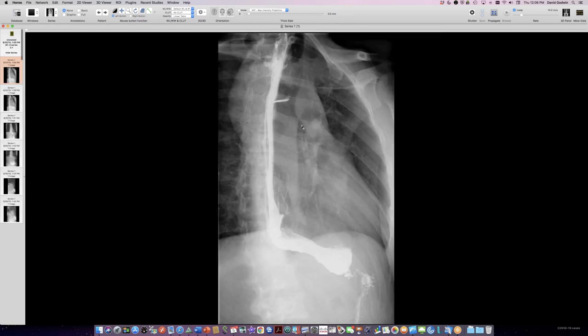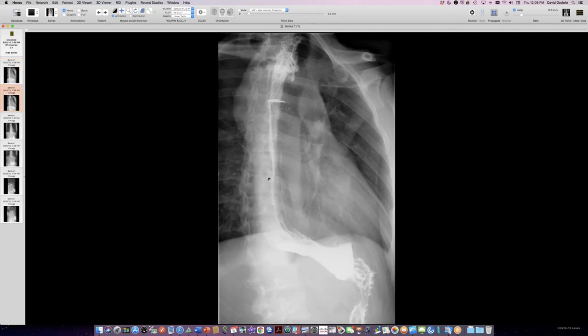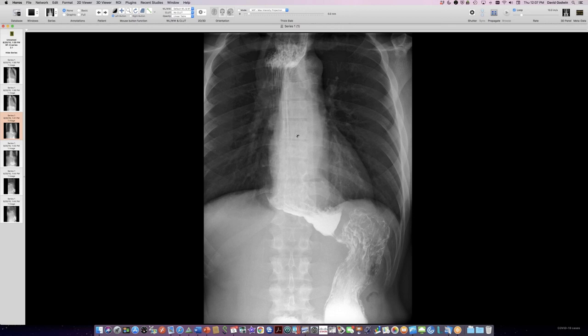And he did have some barium studies. The interesting thing is, on initial swallowing, the barium seems to go right by this big abnormality, just seems to stream right down. You wouldn't suspect from this that there's an abnormality of the esophageal dimensions. But as we keep on going, you see that more and more of this fills out now and begin to fill the whole space there.